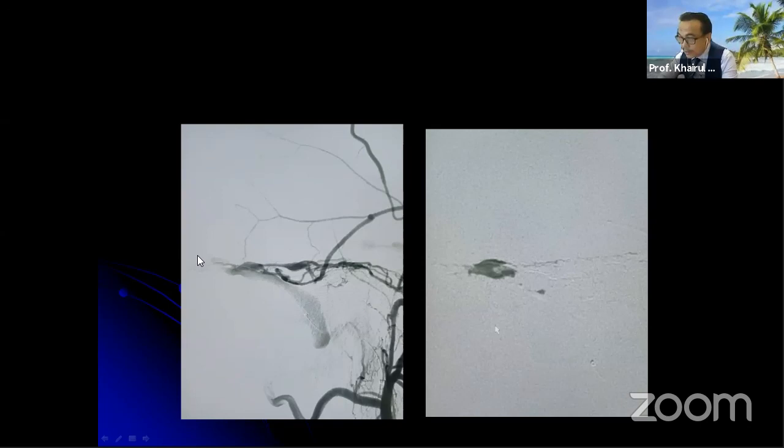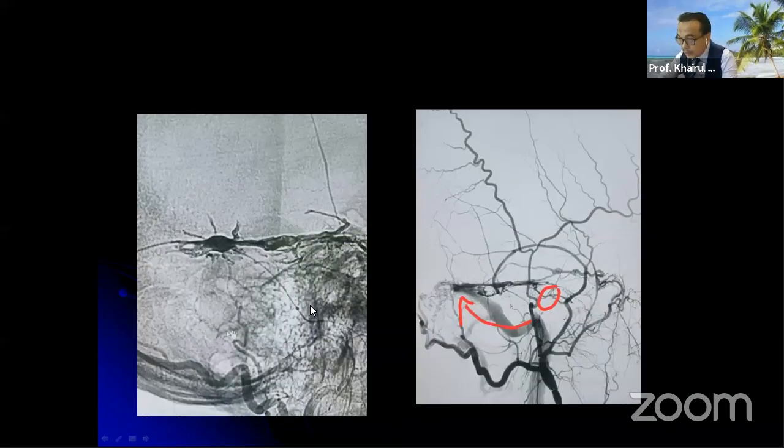So we also need to protect the sinus to prevent material from going to the lung and occluding the sinus. Even as we inject from this segment, we try to push the material as far as possible. During this process, as Dr. Kitipong said, the material can also penetrate to the nerve and cause cranial nerve palsy, like facial nerve palsy, maybe vertigo.